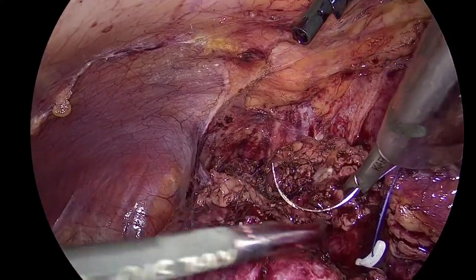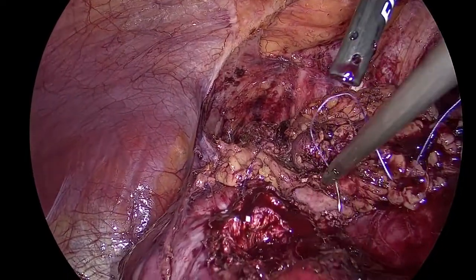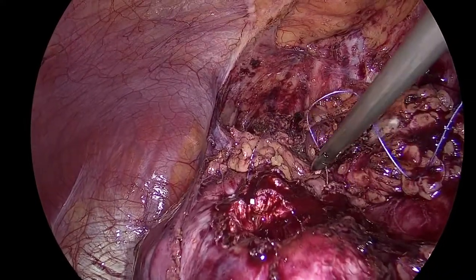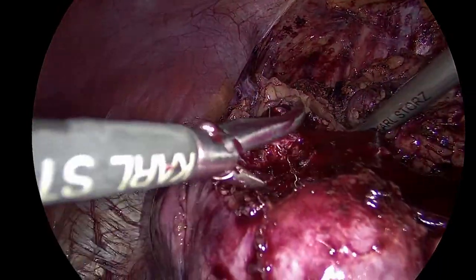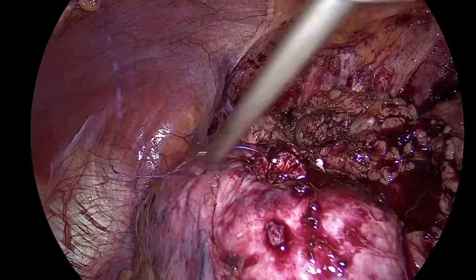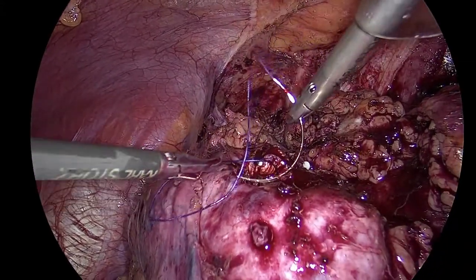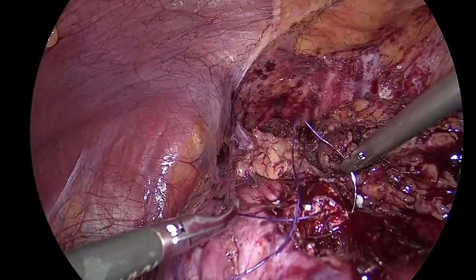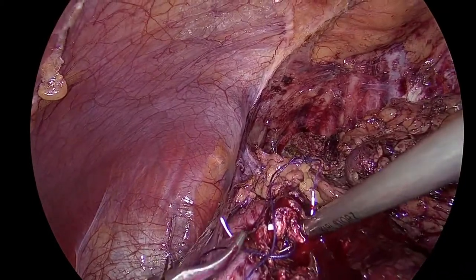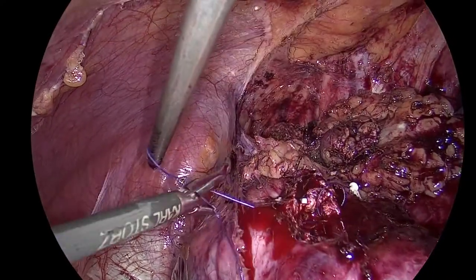Okay, come in, show me. Here I have fat, I don't need the suction now. Evangelos, why do you prefer a harmonic scalpel instead of cold cut excision? I like it because it gives me the possibility many times to do the coagulation nicely and to do a nice enucleation, clamp, clip.